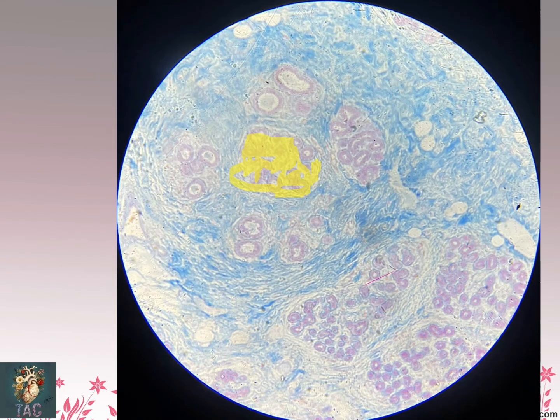In this area you can see a large number of fibers present, and these fibers are irregularly arranged. So this is dense irregular tissue. Here the density of fibers is less, and in addition a large number of cells are present which are forming the connective tissue. So this is a loose connective tissue. By looking at this diagram, you can differentiate between the dense connective tissue and the loose connective tissue which is present over here.